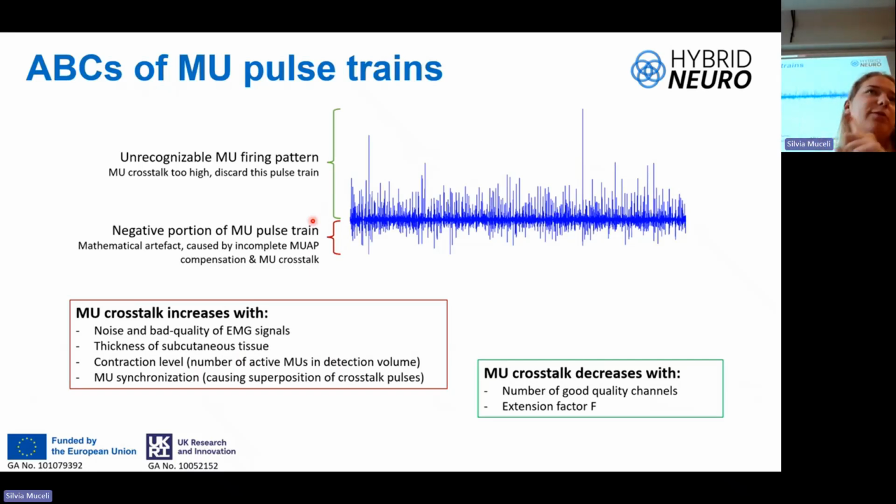Or we'll identify a motor unit that was already identified before, so we will just have a duplicated motor unit, which will later be deleted anyway. Or the most dangerous situation there is, we will synthetically create a motor unit that never existed in the subject. So that's why you should never edit one motor unit too much.